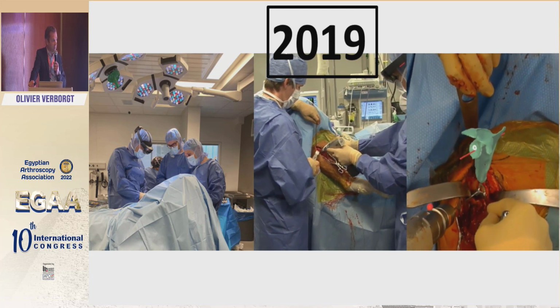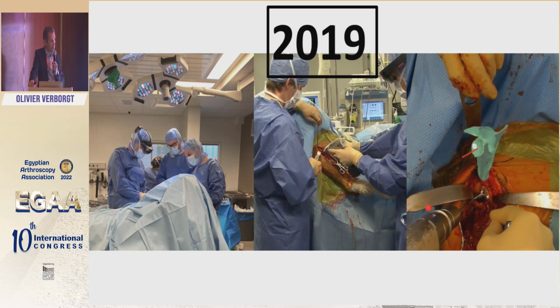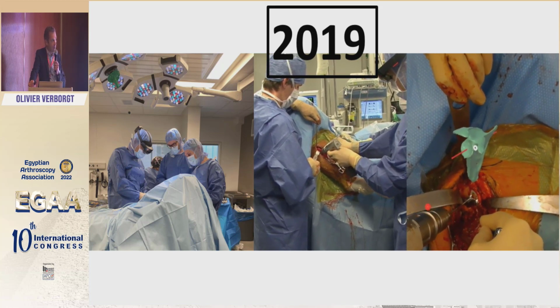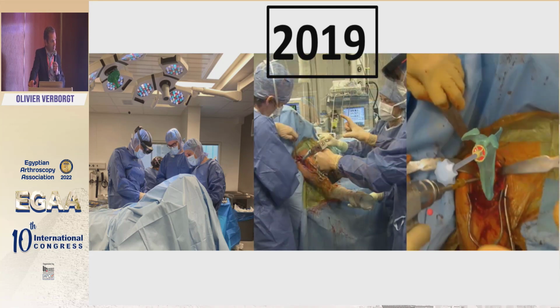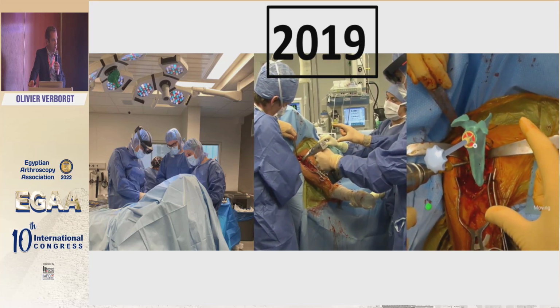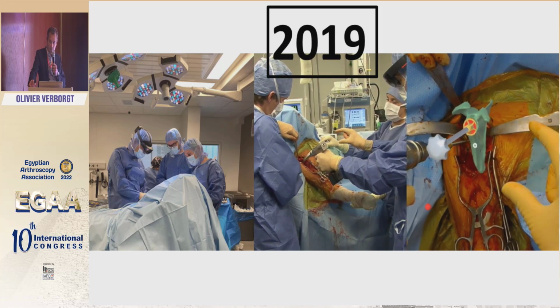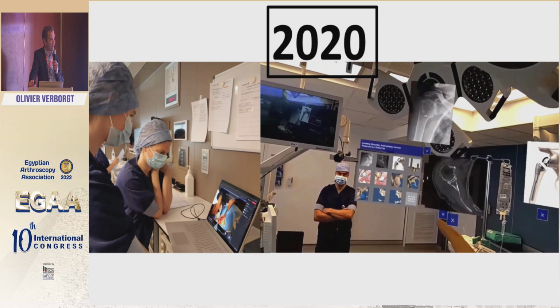But again, it's not really connected to the anatomy of the patient yet, so it's just a sort of advanced imaging tool where we try to use it to get a better implantation of the glenoid component. I think in the future we'll have more of these smart glasses to help us better define the right position. Today we are still only using it as a teaching tool.